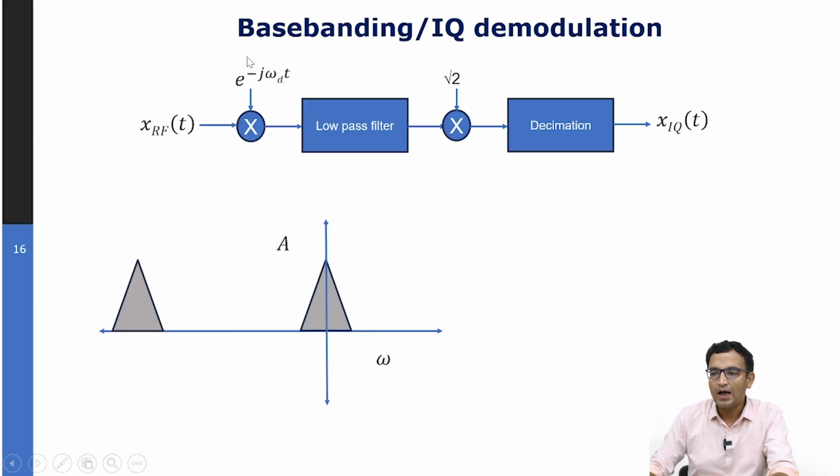So now we have shifted the frequency down by omega d, and by judicious choice of this omega d, we have brought the mean frequency of this spectrum down to 0. So this is now a baseband signal. However, you now have this asymmetry in the spectrum, and this other negative frequency term which does not seem very helpful to us.